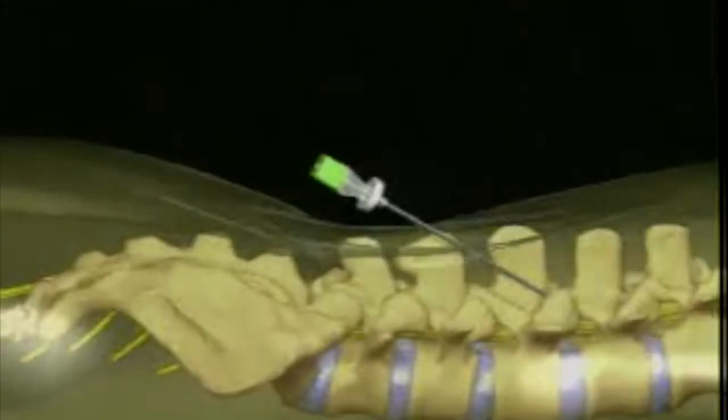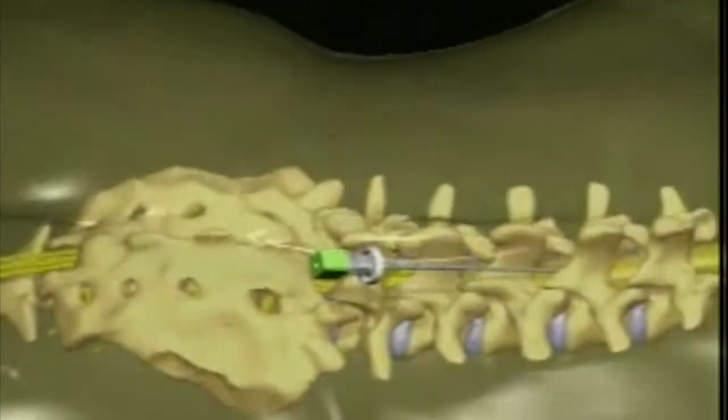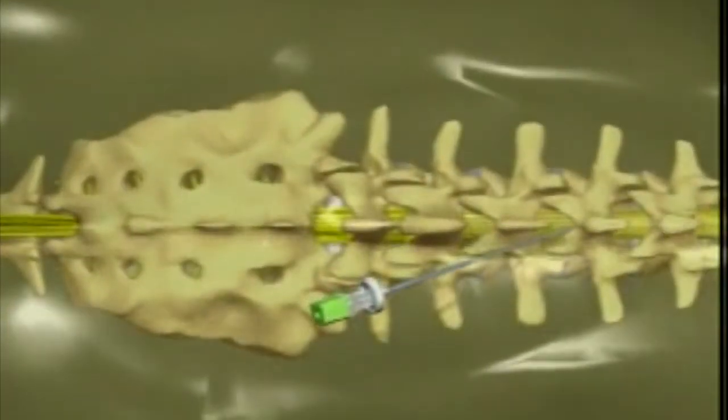The next step is to place the catheter. Use fluoroscopy to identify the intraspinous intervals in the lower mid-lumbar region. A paramedian oblique needle insertion technique is recommended.